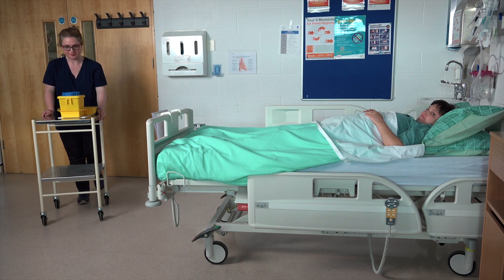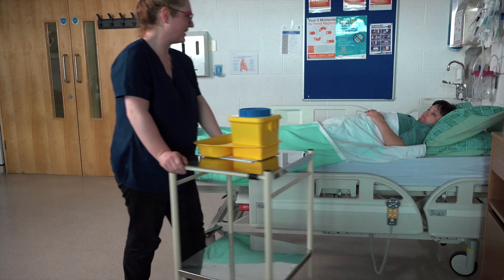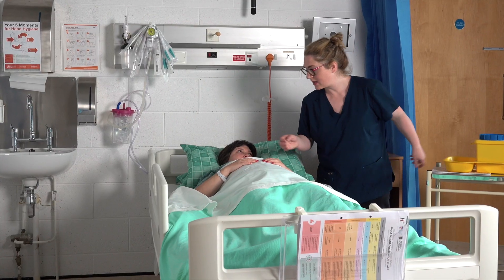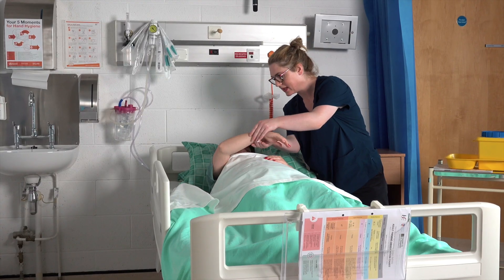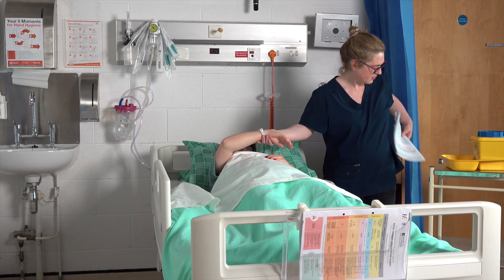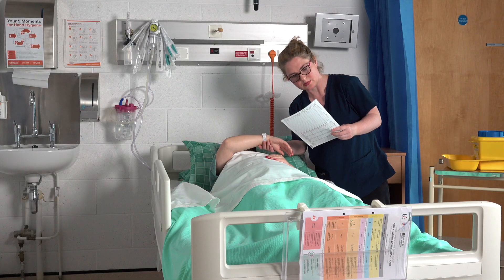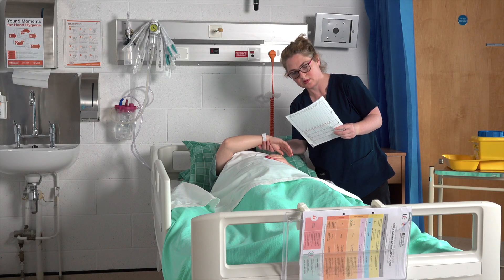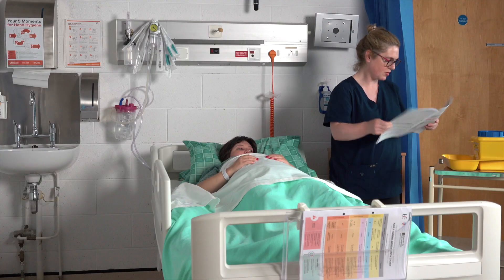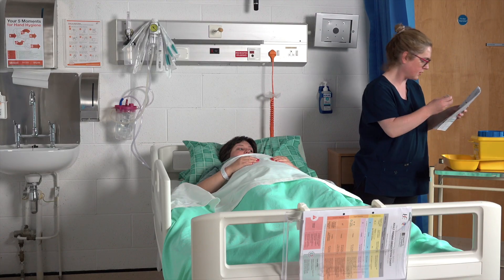Introduce yourself to the patient, explain and discuss the procedure with them, and gain their consent. Ask the patient if they would like a chaperone to be present during the procedure, and check if the patient has any allergies. Follow the 10 rights of medication management to reduce the risk of medication errors. Carry out hand hygiene and risk assess for the necessity of wearing personal protective equipment.